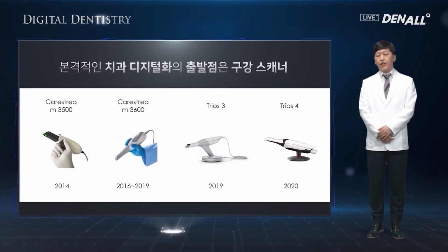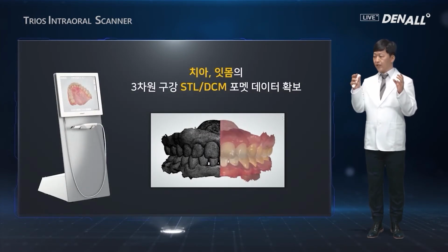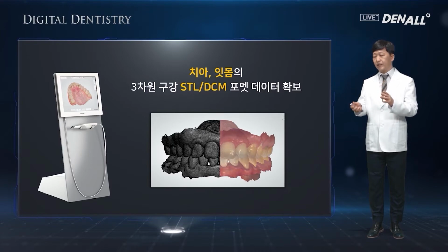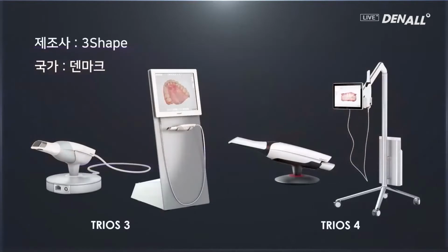Up to now, I have used many different intraoral scanners. The scanners, whatever they may be, their output is in the form of a triangular mesh structure. So the image output data in the form of an STL file can be brought into design programs such as AutoCAD or 3Shape's program. They represent the scanned images in triangular mesh structures. So with this, we are doing the design.